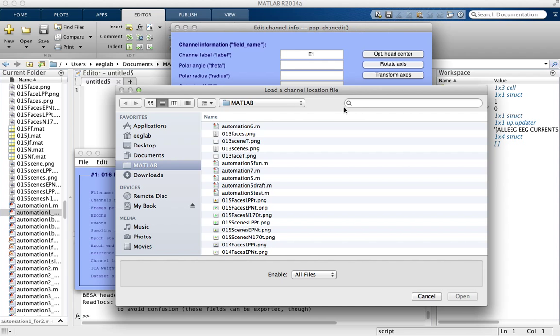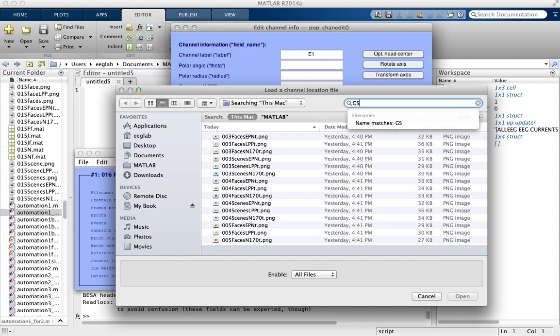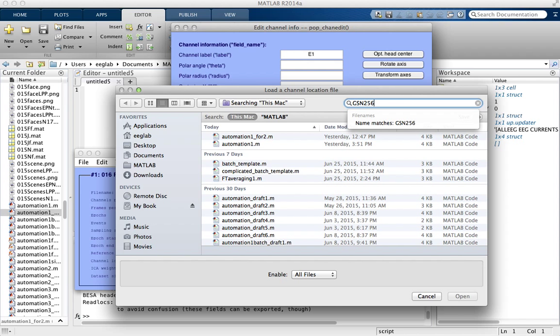Find the file we're looking for, which is GSN 256. This is the 256 ElectroNet, which is what was used for Dr. Tom's dissertation data.